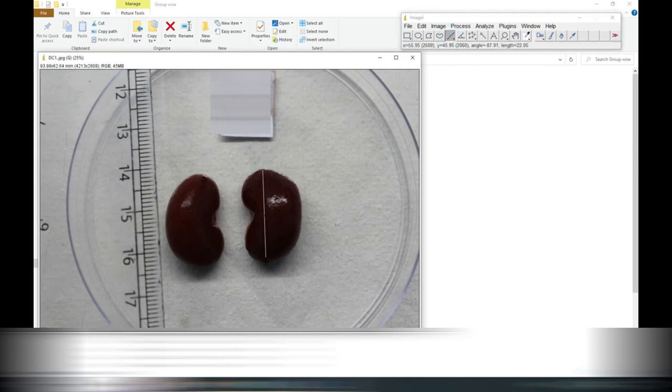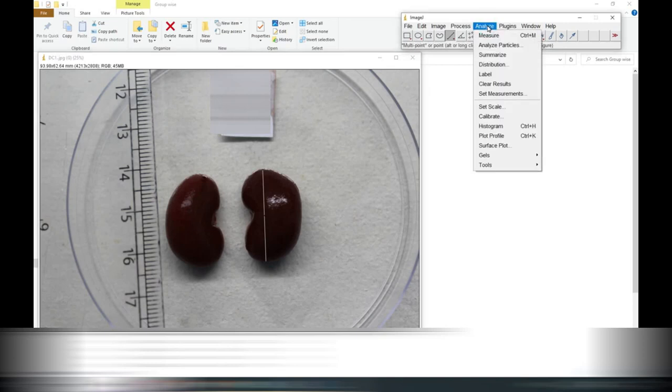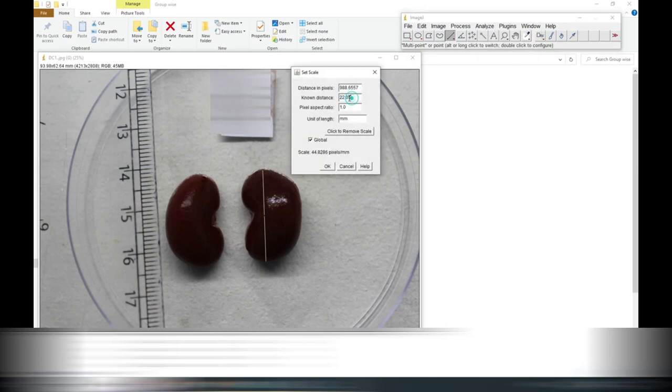Now by the set scale using measure you can also measure and see the known distance but here you can easily see the changes. Likewise you can note this also.